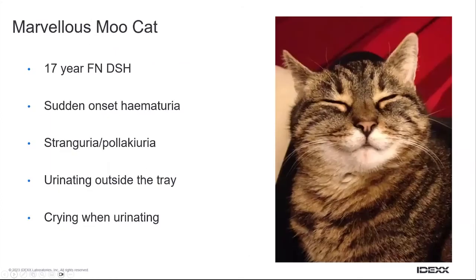disease. So I thought what we would do today is start off using a case study and use that to help us with the approach to an FLUTD case, and particularly with the use of urine analysis in FLUTD investigation. So this is Marvelous Moo Cat. She was actually my cat, so very special. Unfortunately, she's no longer with us. But she's here with us in spirit at least.